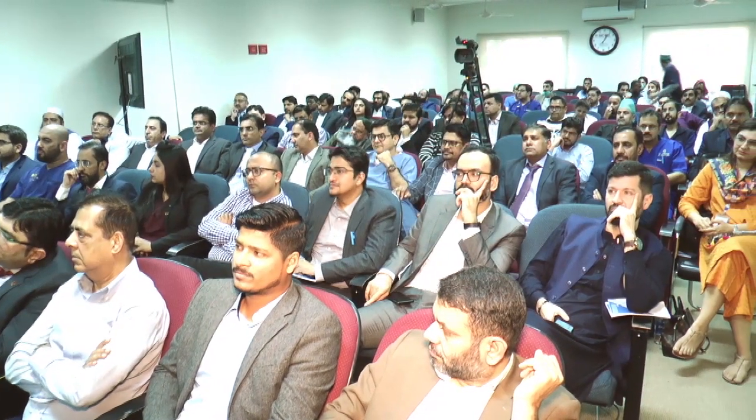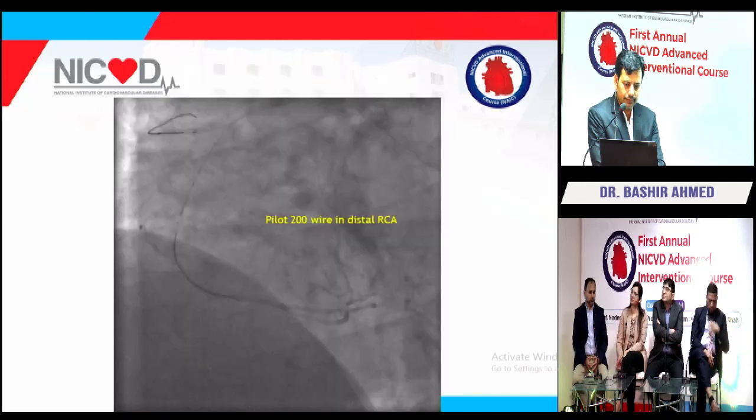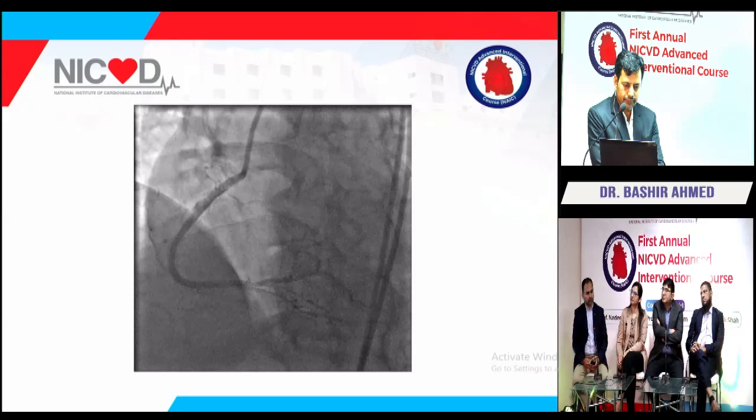So how does the Stingray look fluoroscopically? I think we should wrap up because we're well above time, so just quickly showcasing. The Stingray was used. It's a re-entry device. You either stick with the Stingray wire and swap to a Pilot 200, or you can keep working on the Stingray wire, but it's a needle, so you have to be careful.